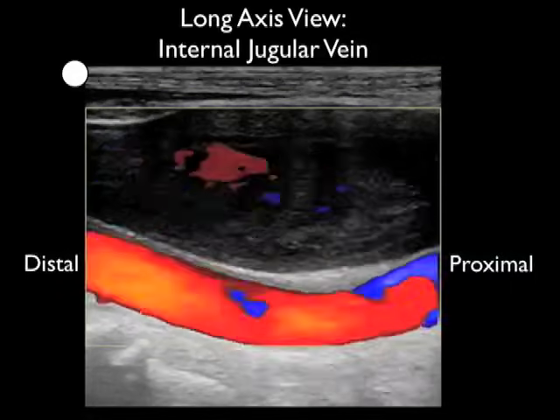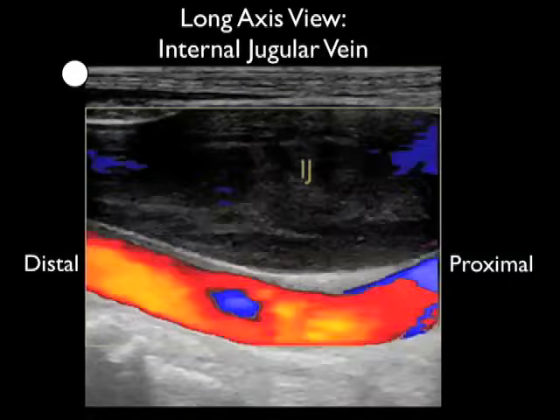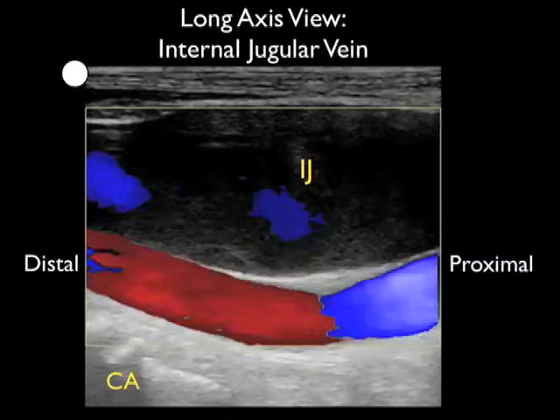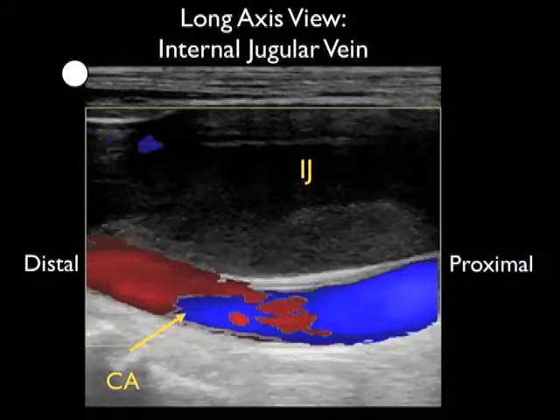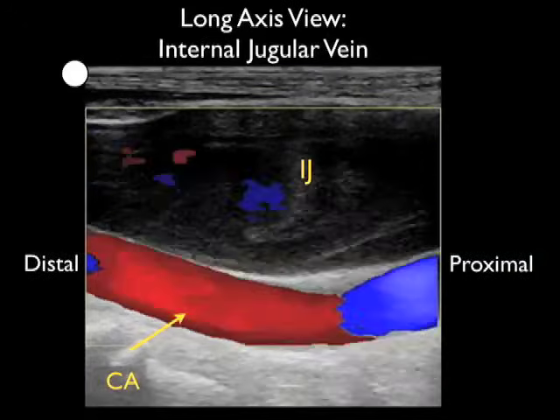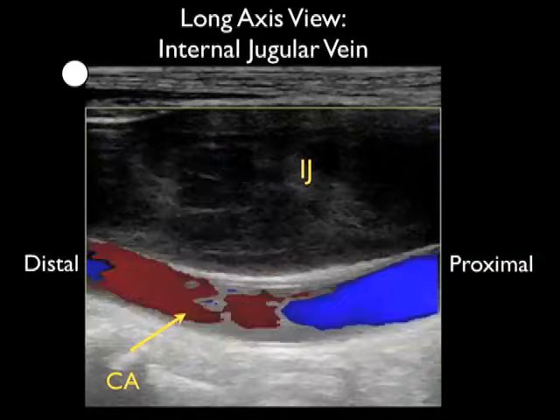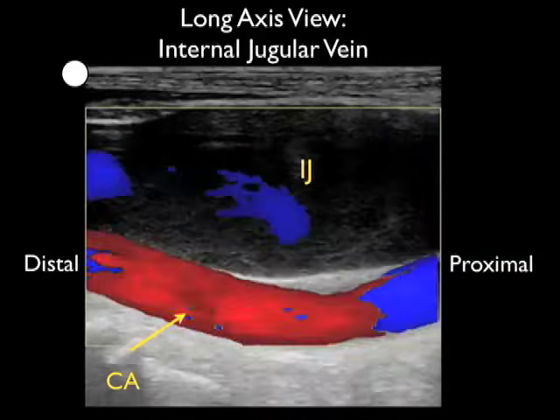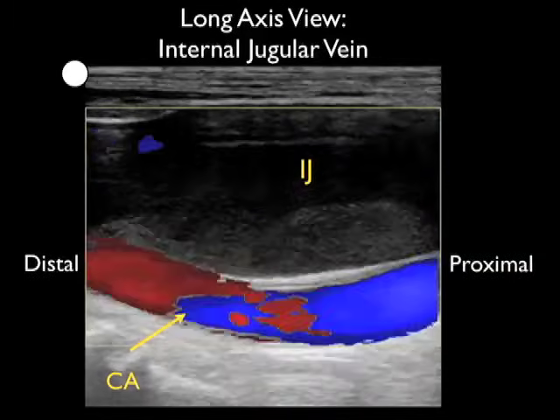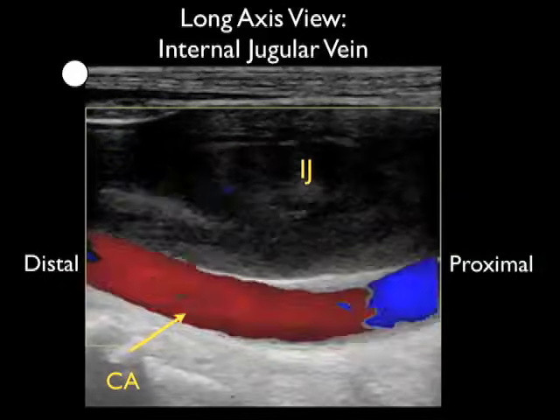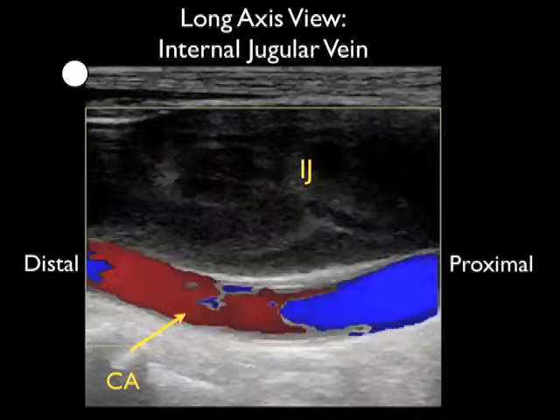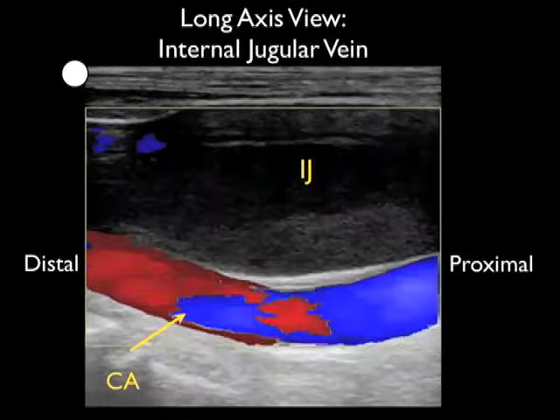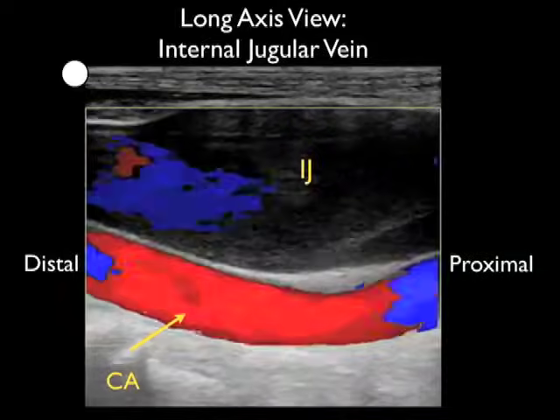Here's a video clip, again a long axis configuration in a different patient, and here we see a much more distended internal jugular vein that's lying on top of the carotid artery. Notice the swirls of blood in the internal jugular vein showing the course of blood flow from high within the neck to the left, to low within the neck here to the right.